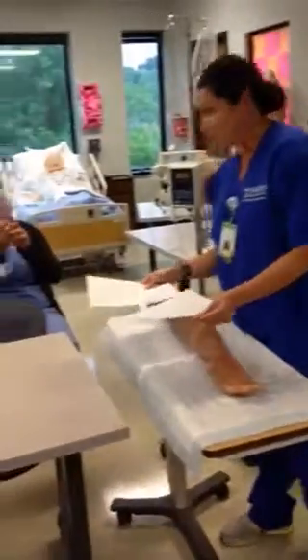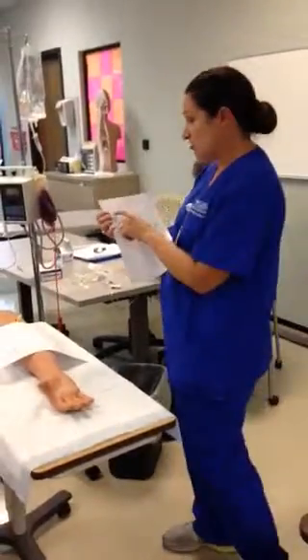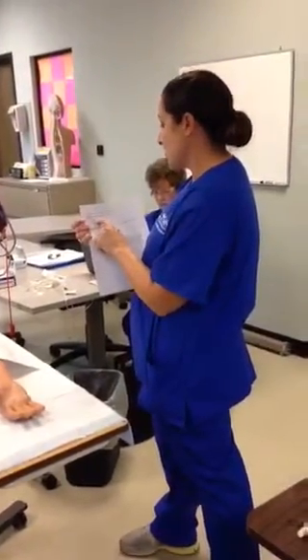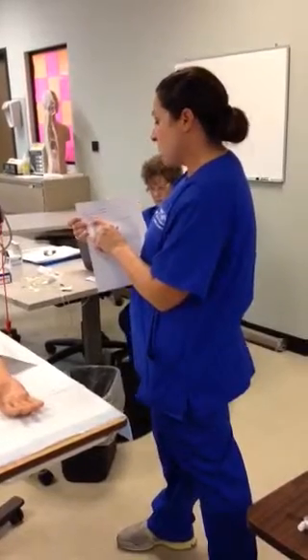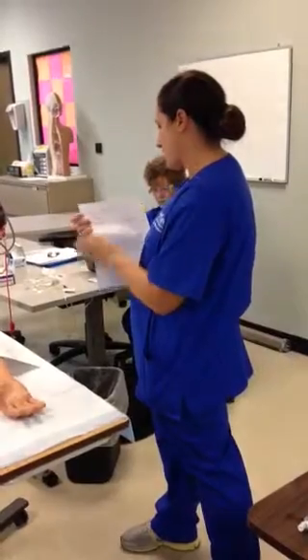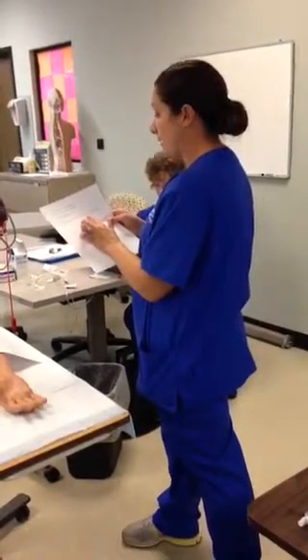Somebody, probably near Ms. Reader, is going to hand you these 2 pieces of paper and sit you down at the table. What I have here is an order. I have a doctor's order to start an IV for IV fluids, lactated ringers to run at 125, and then my Cleocin, clindamycin, 300 milligrams IV piggyback every 6. After I look it up, I know that it must infuse over 1 hour.